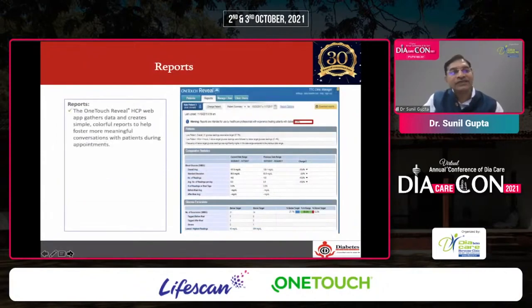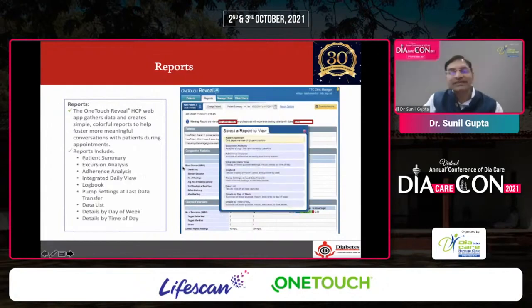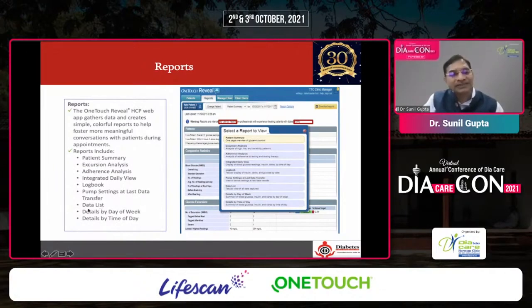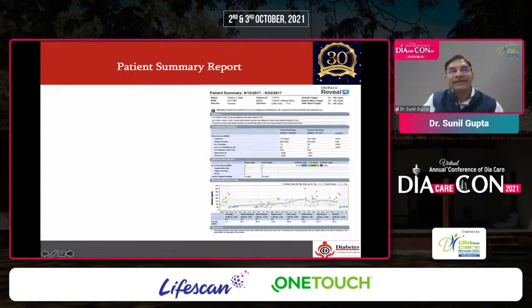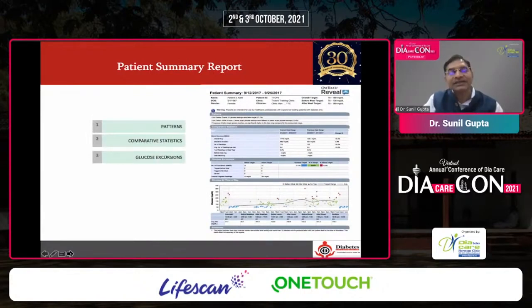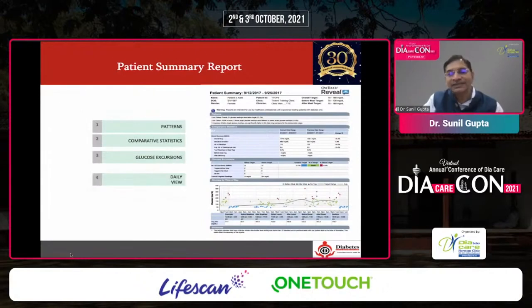The OneTouch Reveal webpage provides multiple fields: patient summary, excursion analysis, adherence analysis, logbook, pump settings if on a pump, intraday details, comparative statistics, glucose excursions, and daily view. The logbook report shows glucose readings organized by the patient's personalized schedule, tracing sequence, time in range, above range, below range, and the exact time each reading was taken.